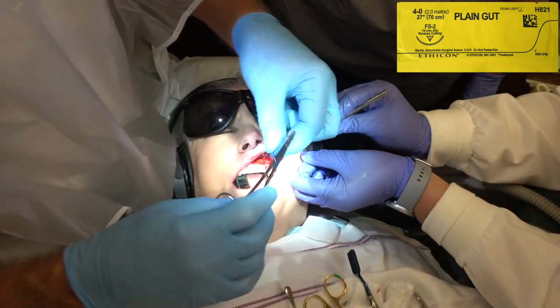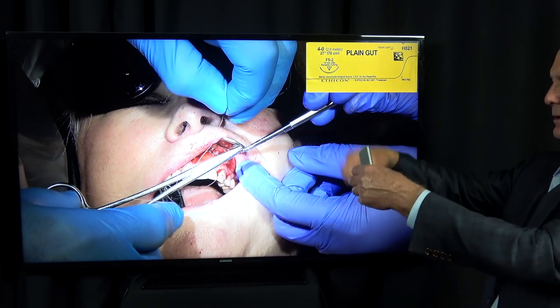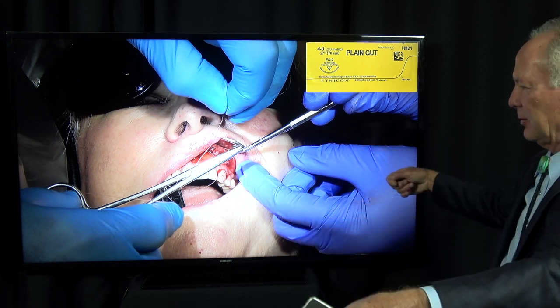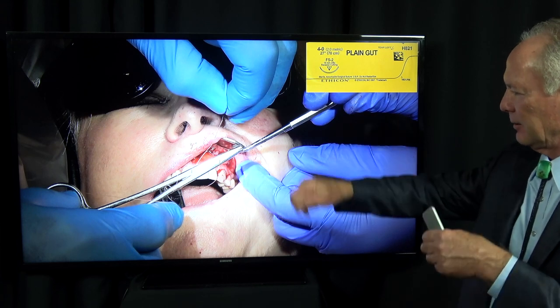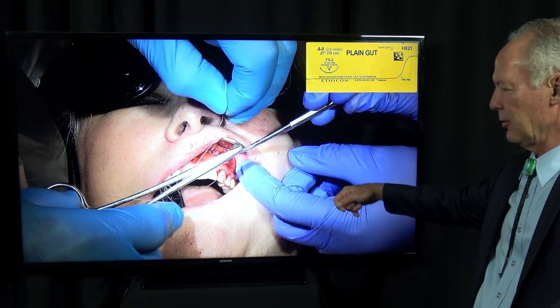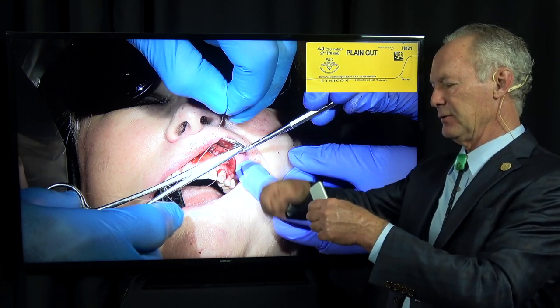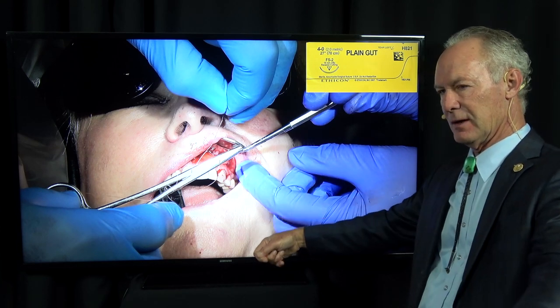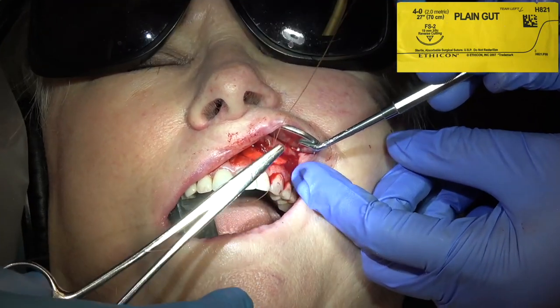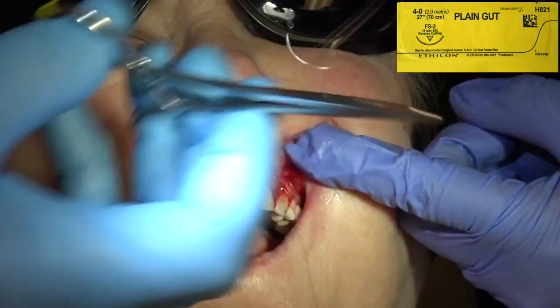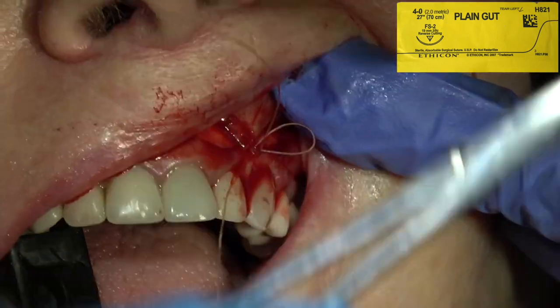So this is a 4-0 gut suture. I go one, two, three away from me when I'm wrapping, pull that tight, then one toward me, pull that tight, then one away from me, pull that tight. The three wraps on the first throw make it hold better than two.